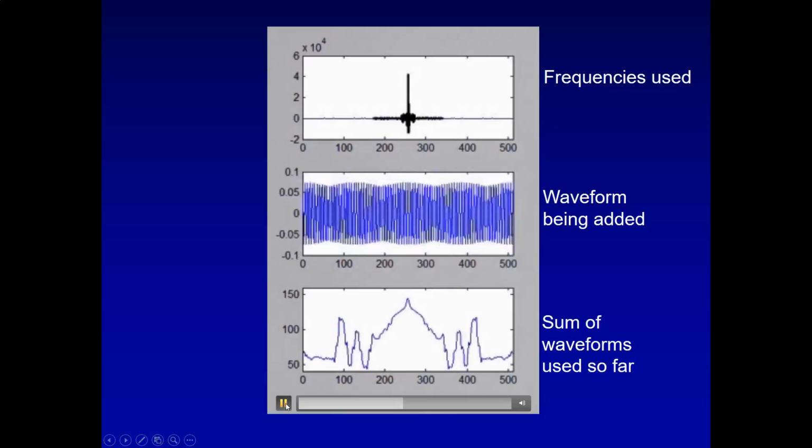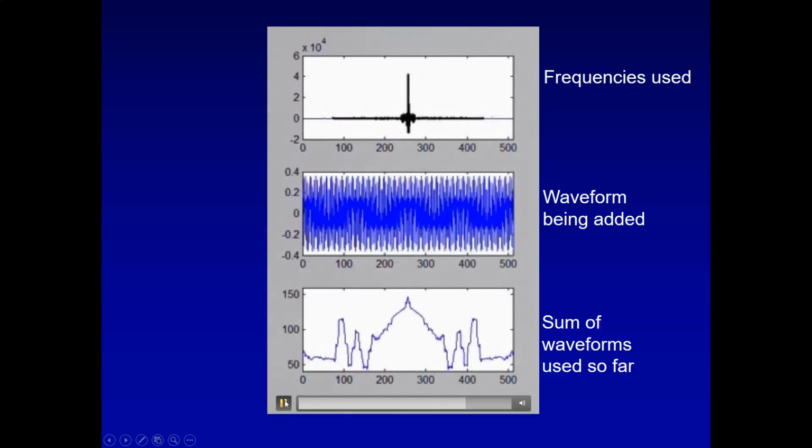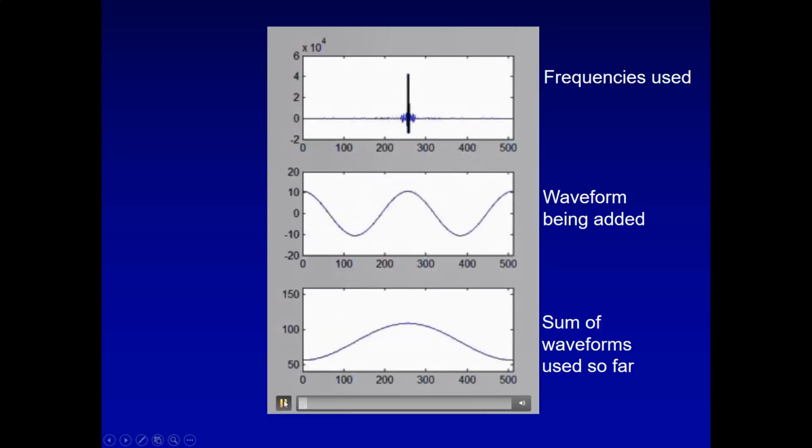If we go all the way to the end, see how we're going farther and farther out in K-space? We're going farther and farther away from the middle, getting more and more details. Here we are. Lots of details. And eventually, you come back to the original object.